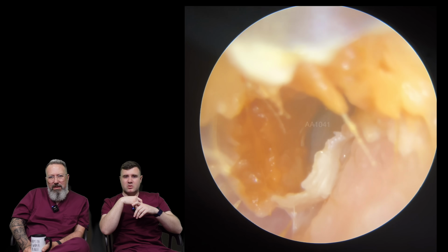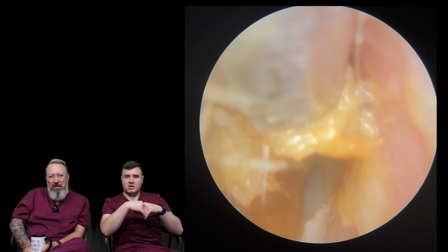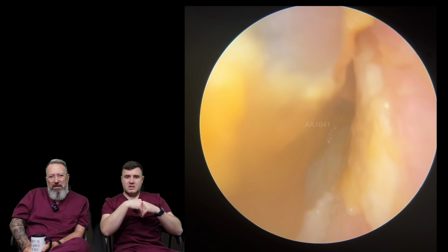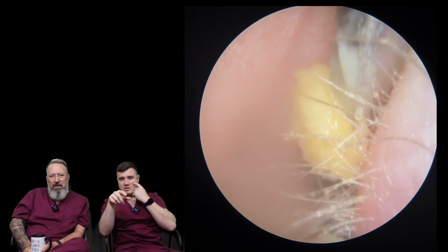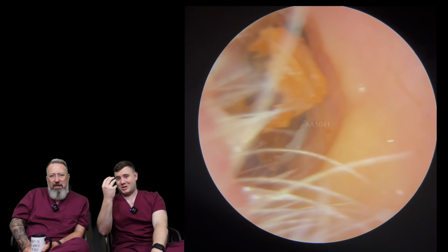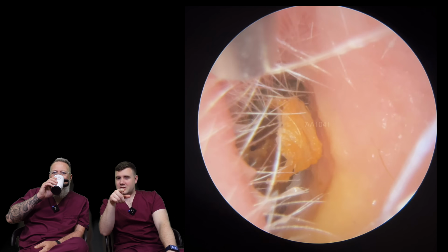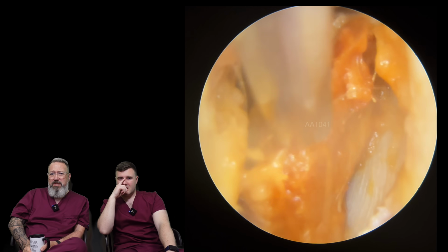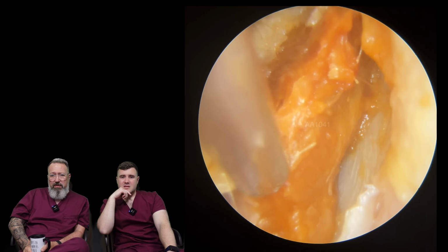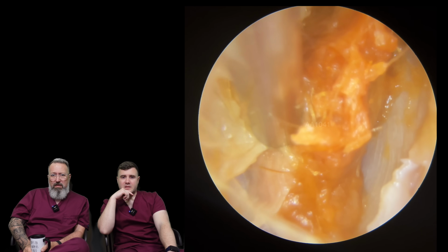But you can see as soon as I got the suction tube onto it, it was just collapsing into the tube. And it's still coming. We've got this big layer here now. I got a little spot on the camera, sorry. It's a little bit blue. Oh, you can see I just shoot up the suction tube. A good piece of skin there, isn't it? I don't actually think there's a ruler shot on this one, because everything's gone up the tube so far, hasn't it? So far, if this comes out in one piece, we might be lucky.